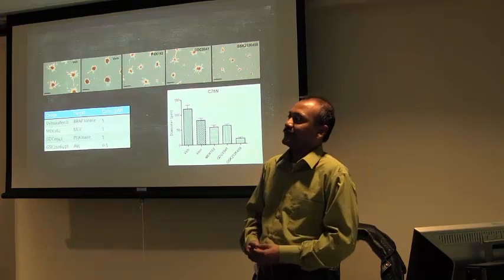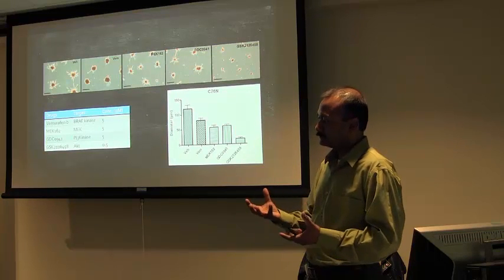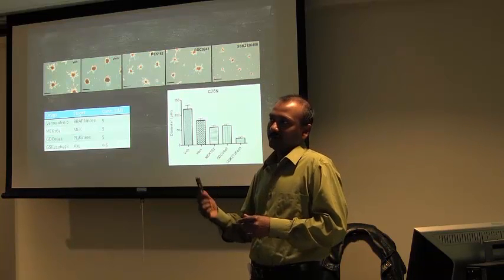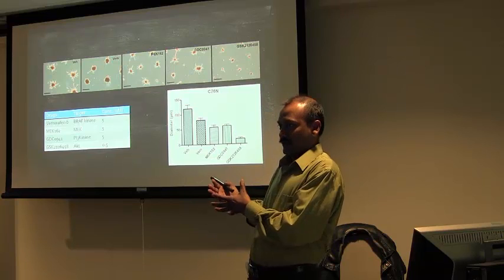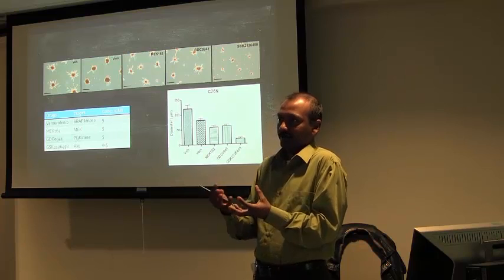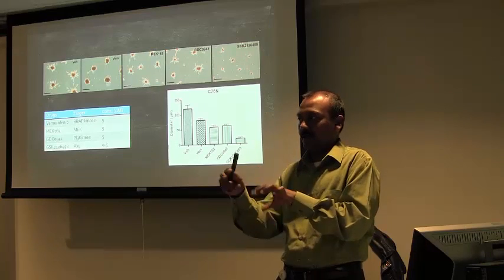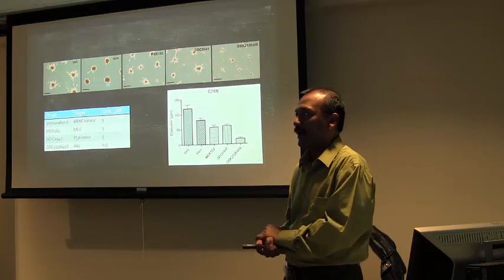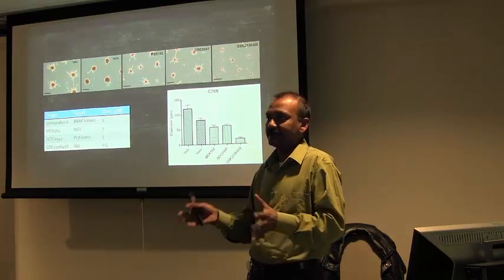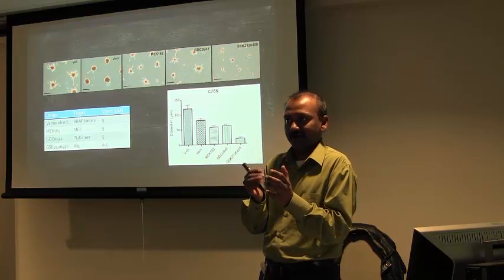Very interesting question. Yeah. In the beginning, when we were toying with this idea of growing these cells in spheroids, the key thing here is the tumor heterogeneity, as you mentioned, that you need to have all the cells. Each one has its own contribution in the tumor. But the problem with these cells is that in the huge lesion you saw, most of the cells are senescent. They don't divide. Only a few of them divide.